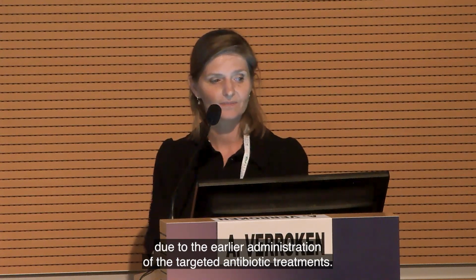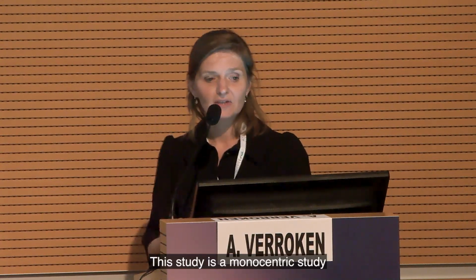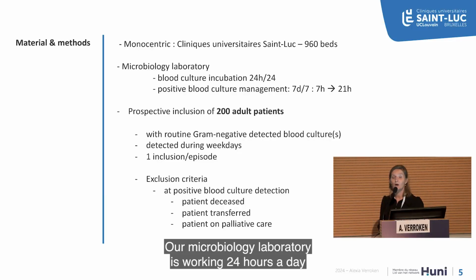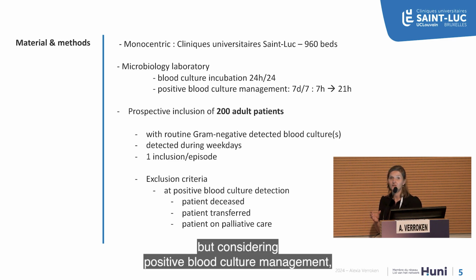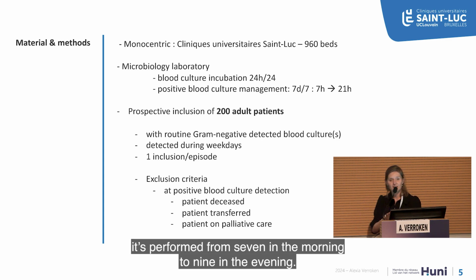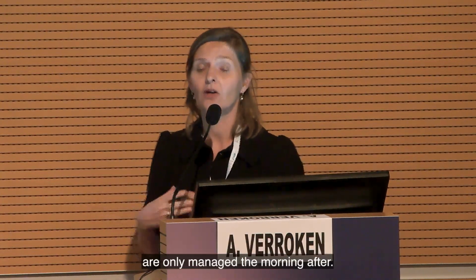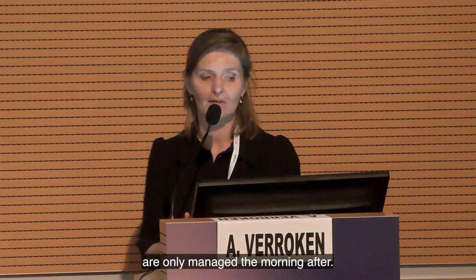And also we measured the time savings that were gained due to the earlier administration of the targeted antibiotic treatment. So this study is a monocentric study that was performed at the Cliniques universitaires Saint-Luc. It's a very big hospital, in the center of Brussels. Our microbiology laboratory is working 24 hours out of 24 for blood culture incubation, but positive blood culture management is performed from 7 in the morning to 9 in the evening. So all the blood cultures, unfortunately, that get positive during the night are only managed the morning after.